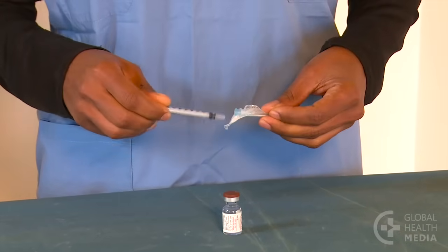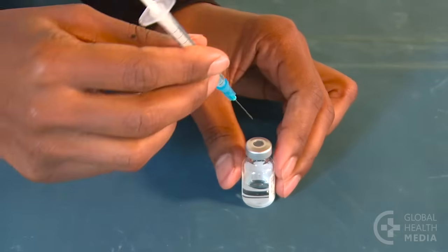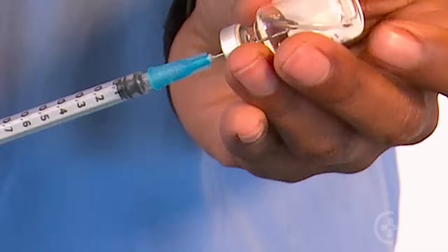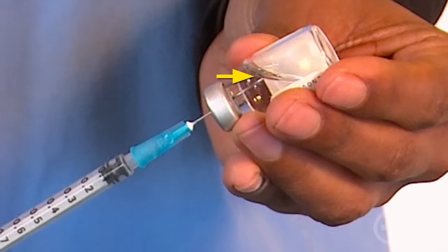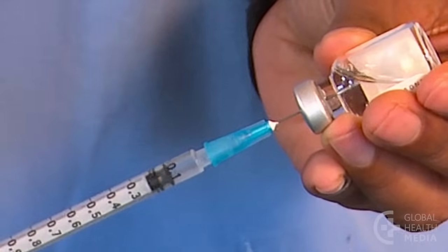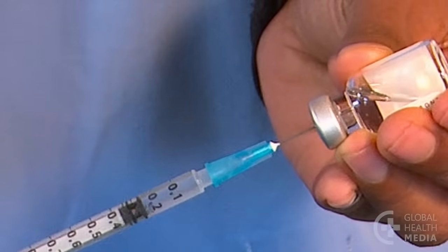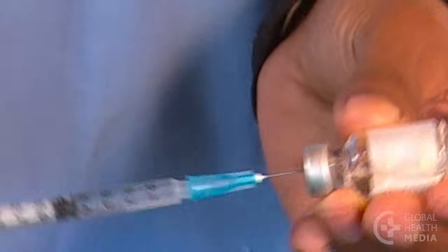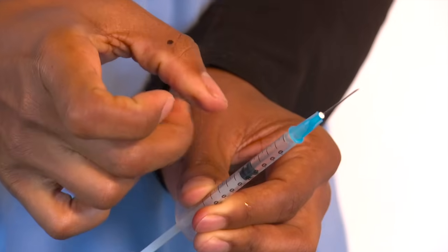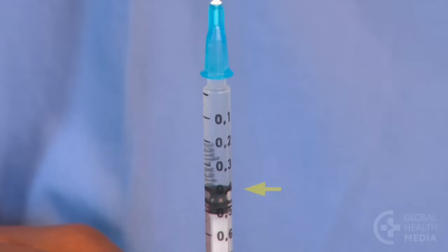Now draw up the medicine. First draw air into the syringe equal to the dose you need, then inject the air into the vial. Turn it upside down, keeping the tip of the needle in the fluid. If you've drawn bubbles into the syringe, push the plunger back and forth to return them to the vial. Drawing up your dose is easy because the air you added to the vial counteracts the vacuum. Now tap the syringe to let any remaining bubbles rise to the top and gently push the plunger to clear them.